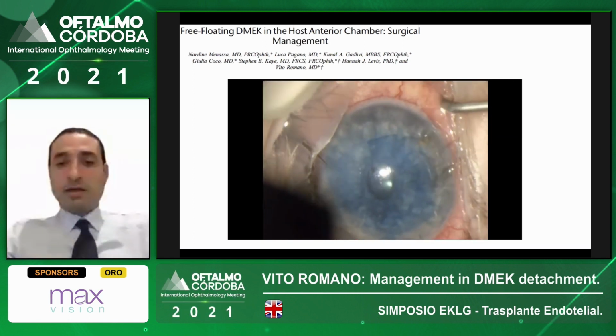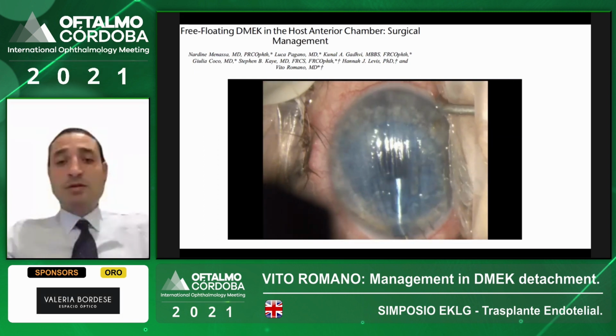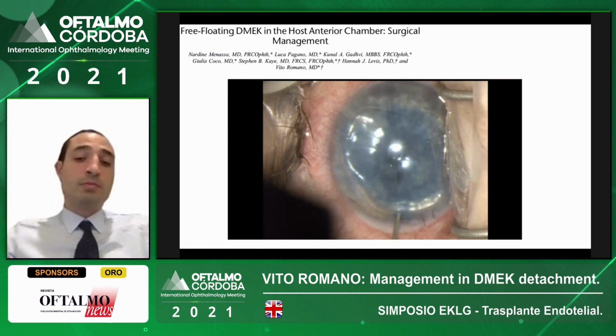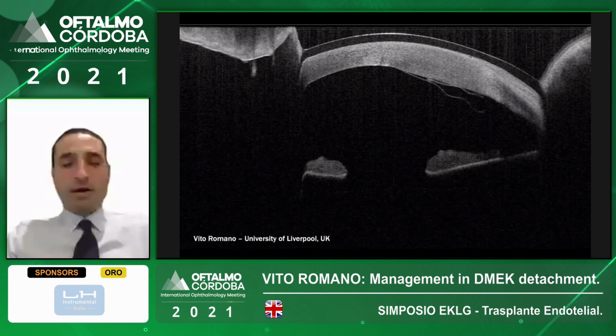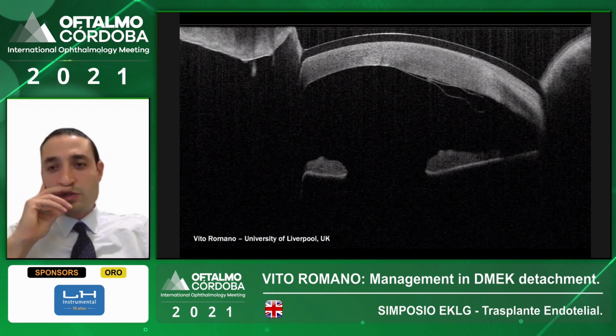This is a way to rescue. If you don't feel that it is good enough to rescue, you always need to replace the DMEK, as Roberto was saying before. What you need to be aware of, as Roberto has well pointed out, when you do this descemetorhexis, is that it's quite an important time.